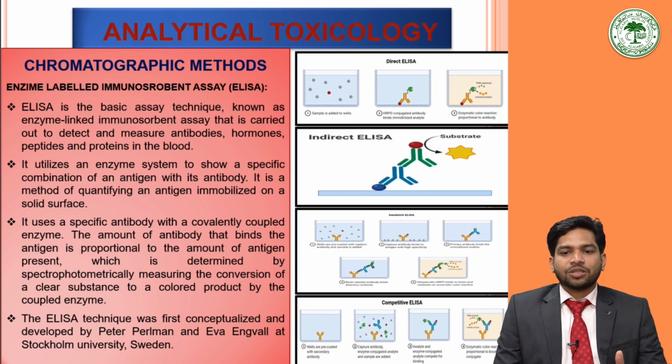Here the sample suspected to contain the drug X is put in a reaction tube. In this method, a plate or a tube already containing the antibody to the drug X is bound to that plate.